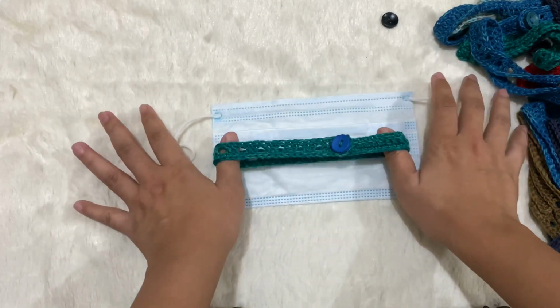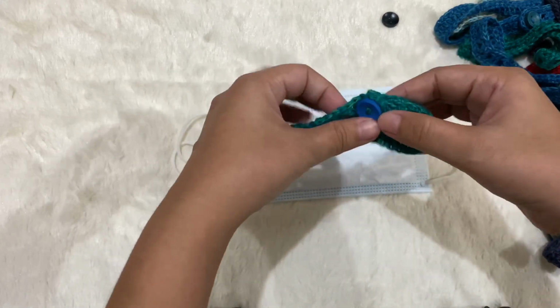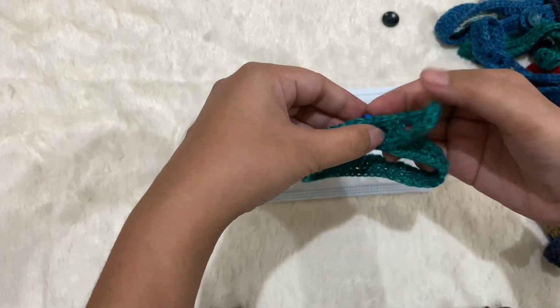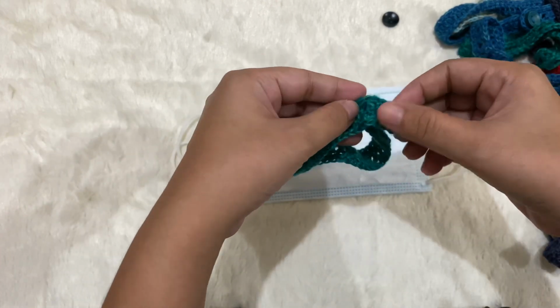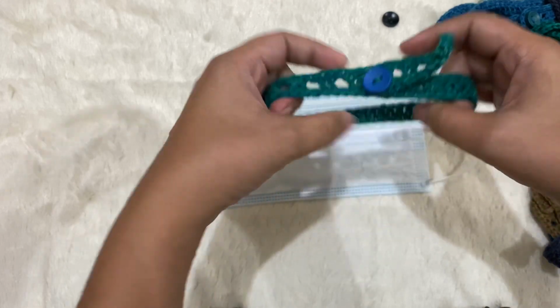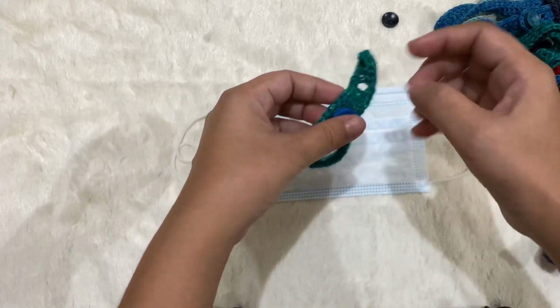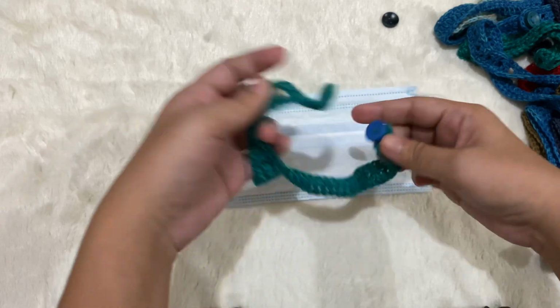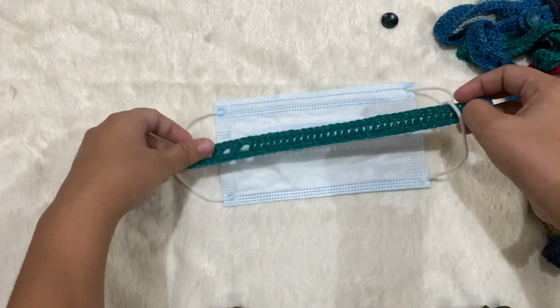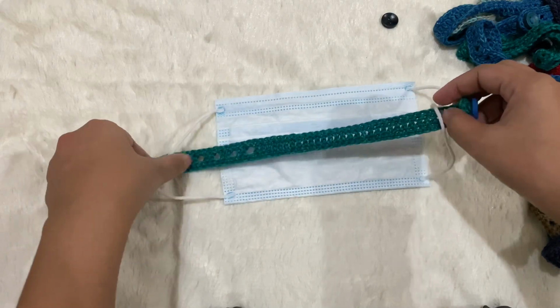You may have seen a different design before, the one with two buttons, but I like this one better, the one button adjustable design. And this is the one that I am making right now. I have seen patterns around, but they don't work with me because they use a different weight yarn than the one that I have. So I made this guide or tutorial that will work with many different yarn weights.